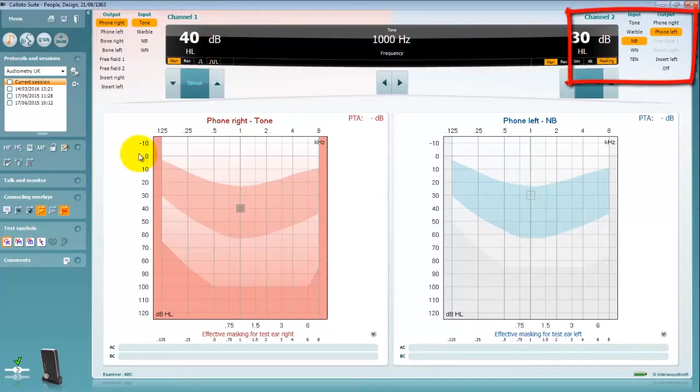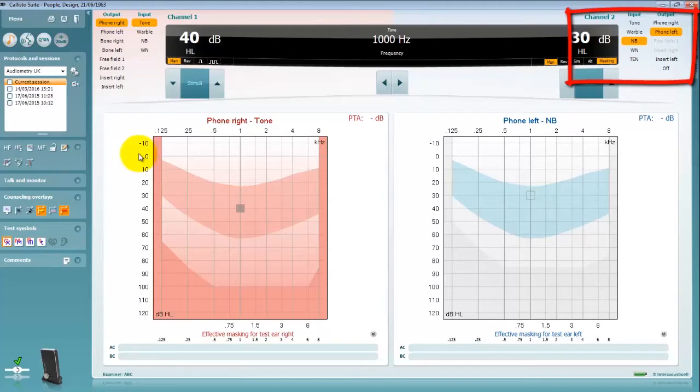Channel 2 is always your non-test ear and used specifically when masking. The system is configured to always switch to the opposite ear whenever you change the test ear.